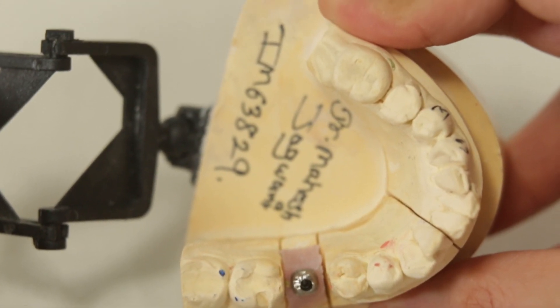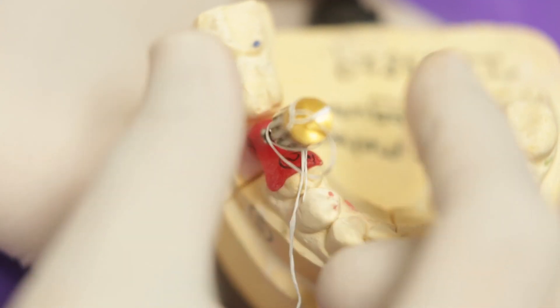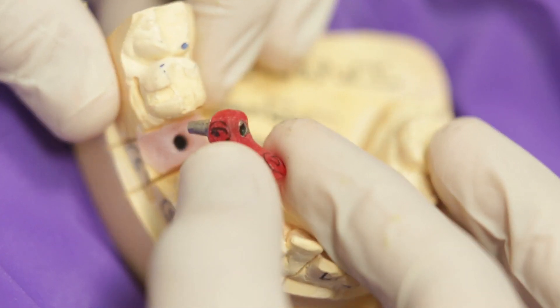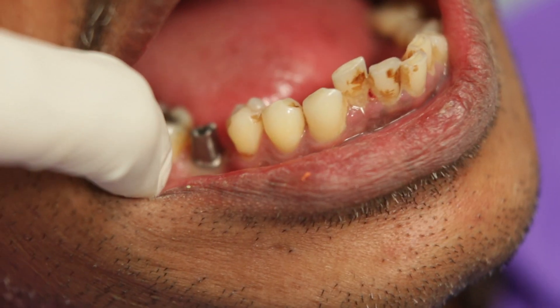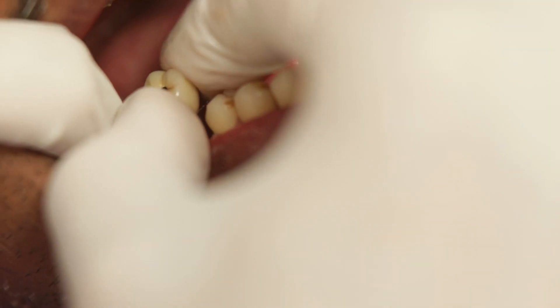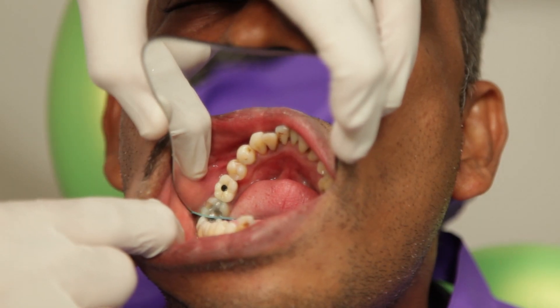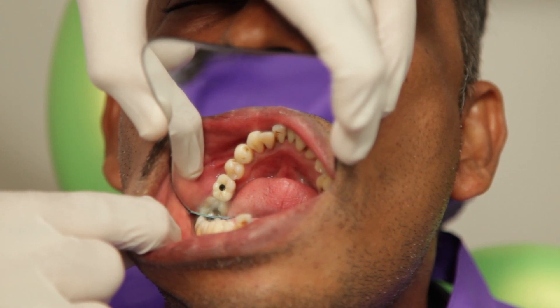Here I have a smart abutment and a crown fabricated with this particular impression. This is a transfer jig which I will use to orient the abutment correctly onto the implant. I will now tighten the abutment screw and remove the jig. As you can see, the smart abutment is anatomic, resembling a molar tooth. I shall now try the crown onto the smart abutment. At this stage the occlusion can be verified and adjusted if required. The crown can be cemented after torquing the abutment.